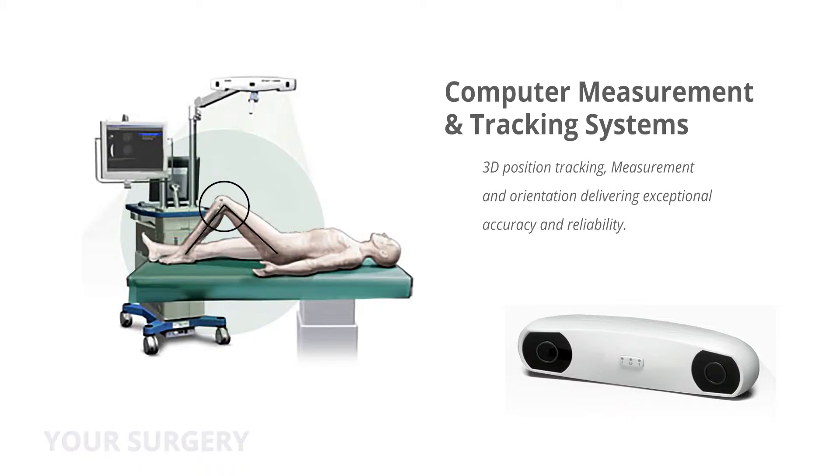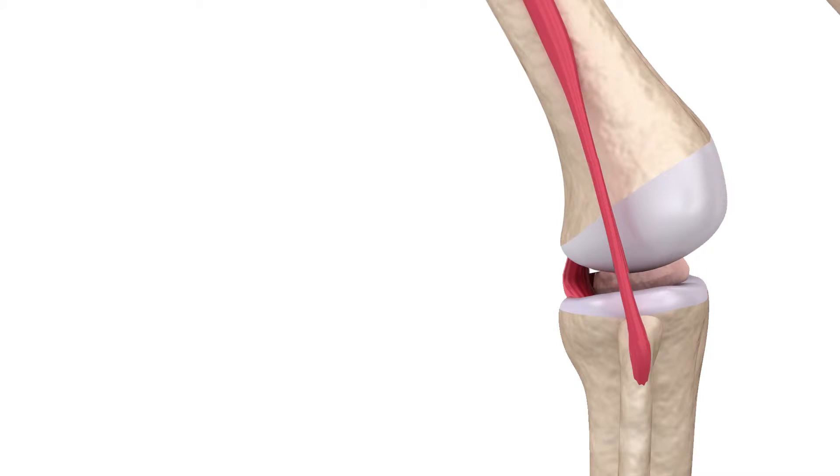Then your surgeon will carefully measure your bones and cut away the damaged bone and cartilage. The femur is then reshaped to match the implant, and your surgeon will attach the implant to your femur with bone cement to fix it in place.